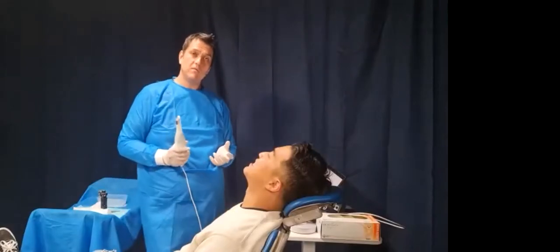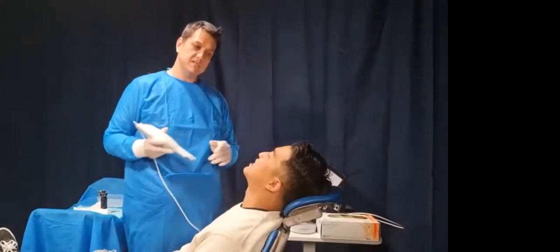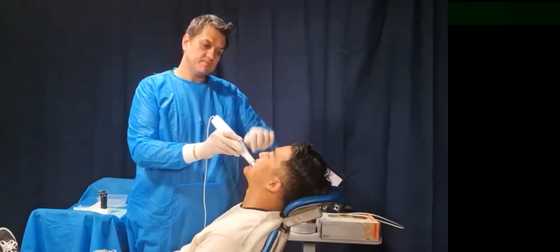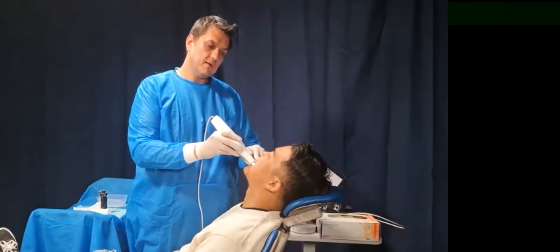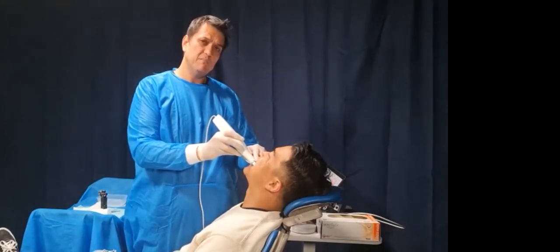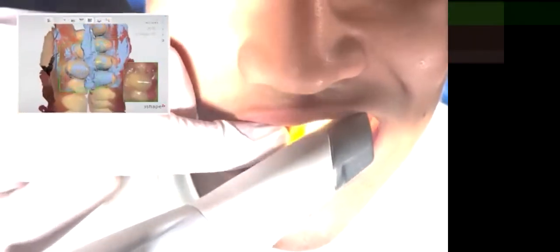As I pick up my scanner, I'm going to place my scanner down as far as I can to the posteriors, like so, and we're going to turn our scanner on. Now our scanner is running. Mr. Cameraman, can you just come back one more time? Have a look at this position. Just watch my scanner. So there you go. Geez, it was like 2 seconds and it came together. You heard the magic sounds and you saw it on our screen. But all I'm doing, and I'm going to keep going now anyway, is just running around.